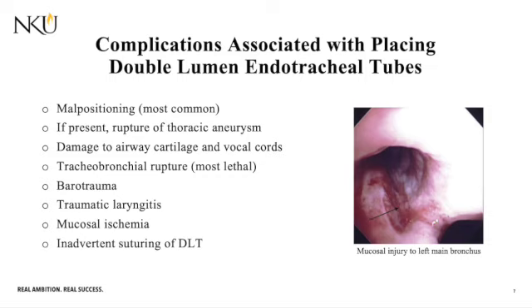Now let's review how to set up for a double lumen endotracheal tube placement. First, you'll want to grab your bronchoscope, along with the scope, the screen, and anti-fog. Next, you'll want to grab your video laryngoscope, such as a McGrath or GlideScope, a 10 cc syringe, and a 3 cc syringe. You also want to grab your double lumen endotracheal tube, which comes with the ventilator connections and suction. Lastly, you'll want to make sure you have a clamp and either tape or ties to secure your tube.